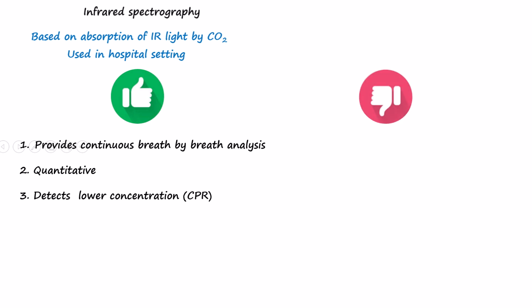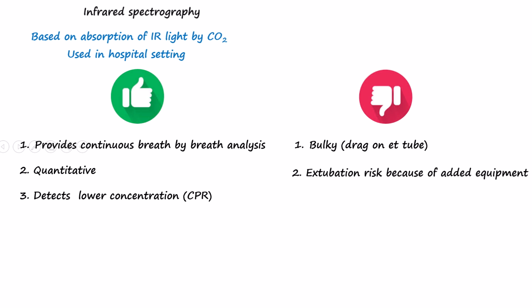One limitation of this method is that the sensor used can be bulky, potentially adding strain at the end of the endotracheal tube. Additionally, sample tubing or electrical lines connected to the ET tube can increase the risk of unplanned extubation, posing a sudden airway emergency.